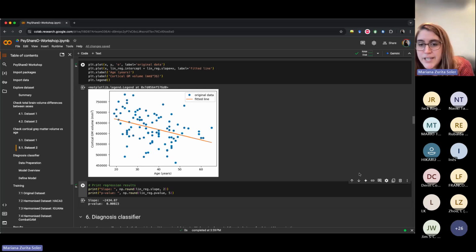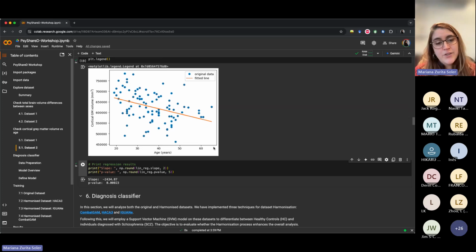Now I want to see if there are any questions at this stage. Give a little pause or a little bit of time, because in the next part we're probably not going to finish looking at every single bit of it, but at least you're going to have access to the notebook. So you can use these tools.